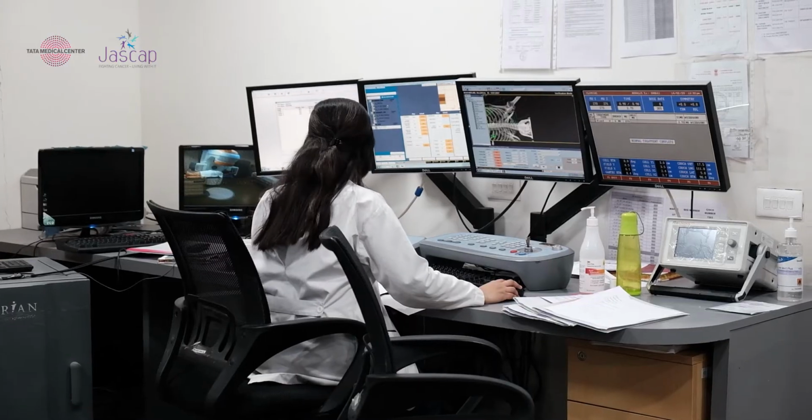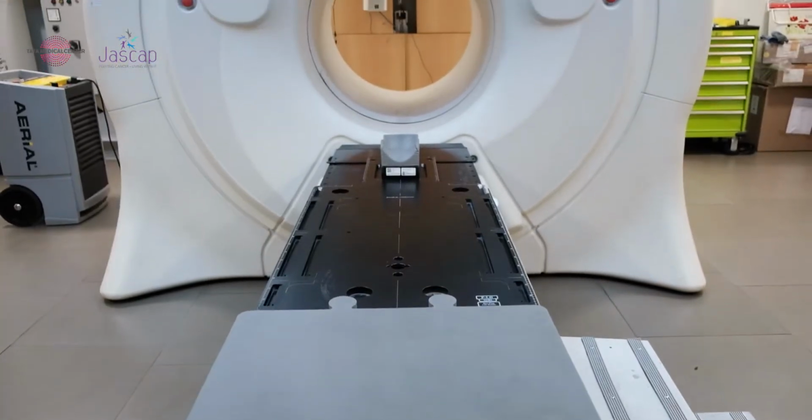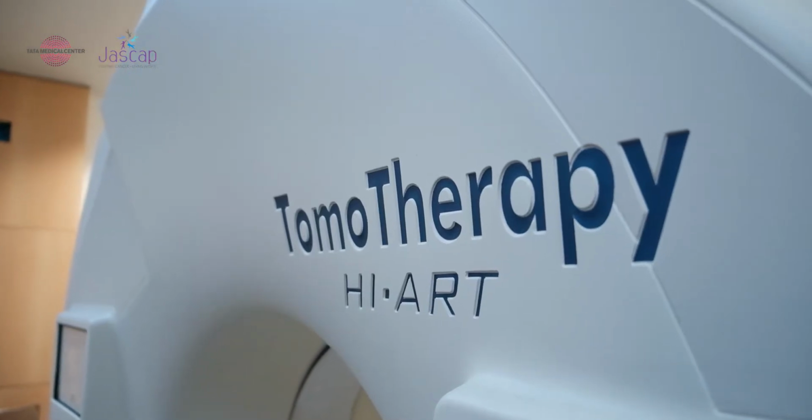So in the radiation therapy planning process, you will be asked to follow a set of instructions by radiographers, who are special engineers or trained technicians to operate a few machines. You will first report to a radiation waiting area, and then you will be called into a machine room which has a lot of safety equipment that monitors the patient inside and out, and it is a very simple CT scan machine. Most of the radiotherapy planning appointments are painless.